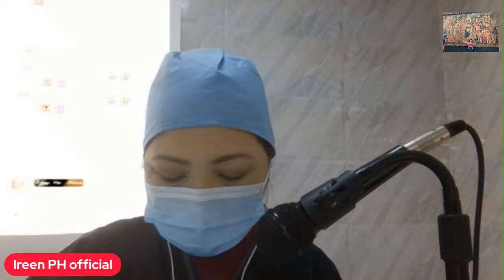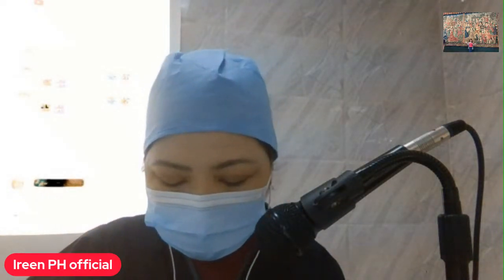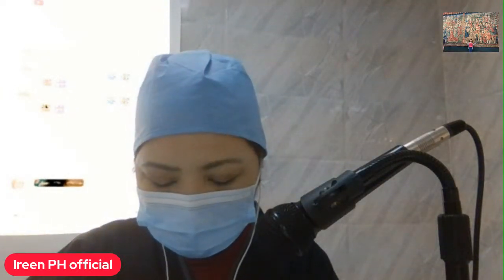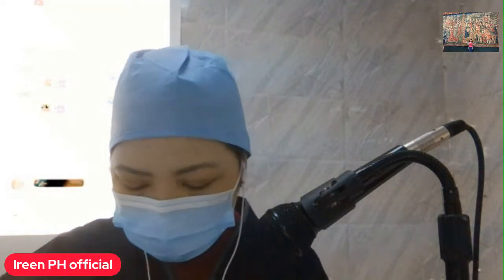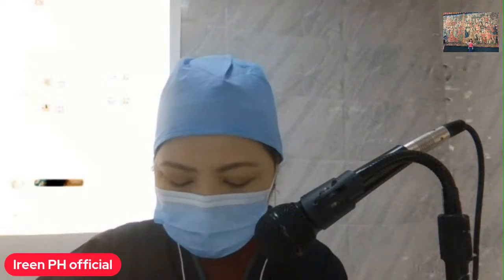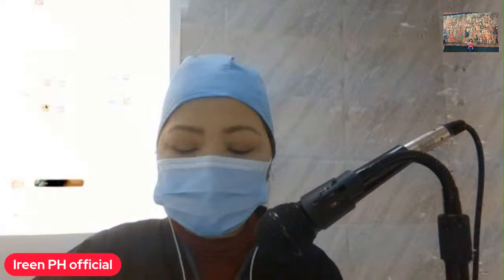And what is blood banking? It's the process that takes place in the laboratory to make sure that donated blood or blood products are safe before they are used in blood transfusions and other medical procedures.